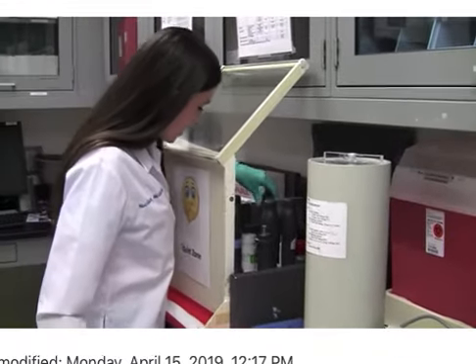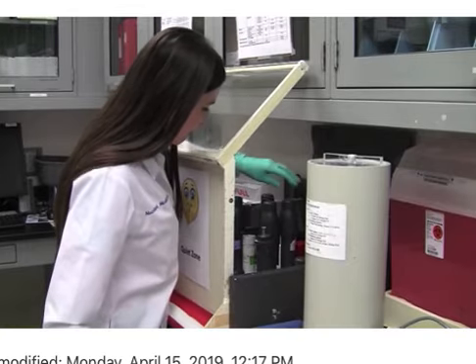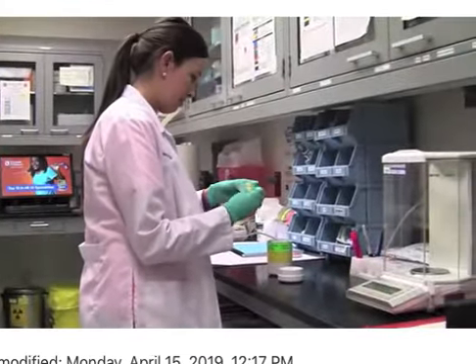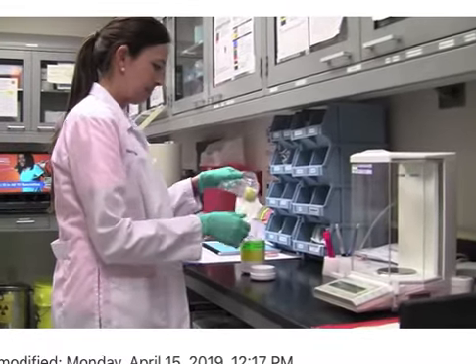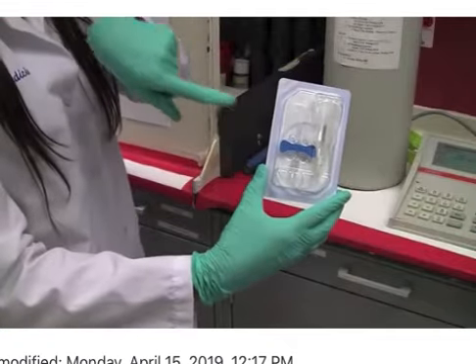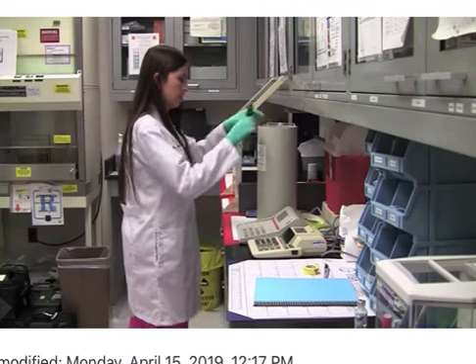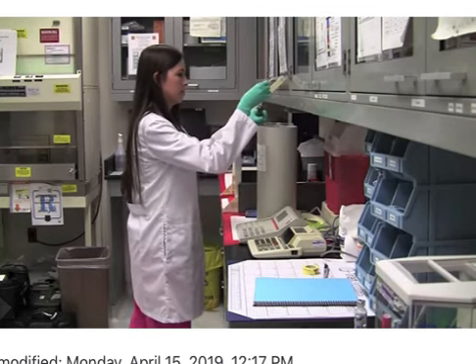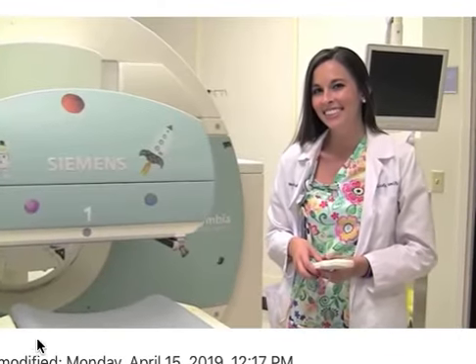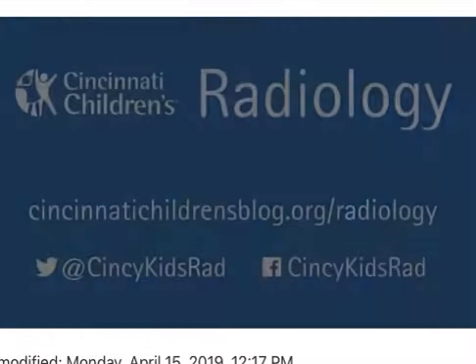The radioactive medicine we use is not harmful and there are no side effects. This medicine comes in different forms. We do tests where you eat a radioactive egg or swallow a pill, but most of our tests involve getting the medicine into a vein with a butterfly needle or IV catheter. Now that you have learned about our hot lab, hopefully you have a better understanding of what we do and how we help our patients in nuclear medicine.